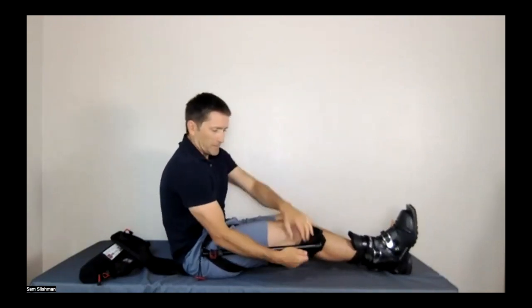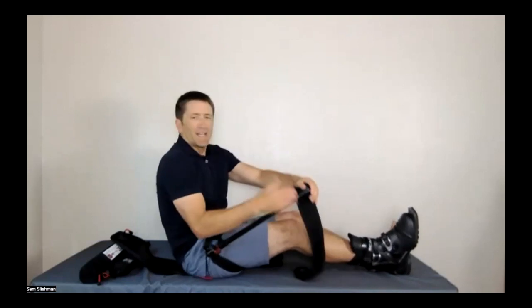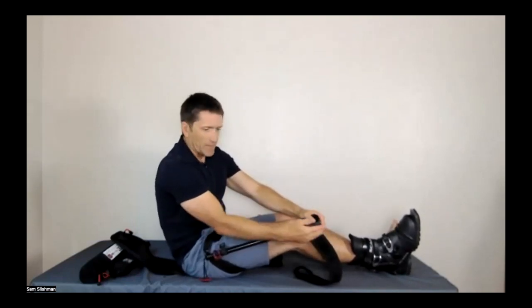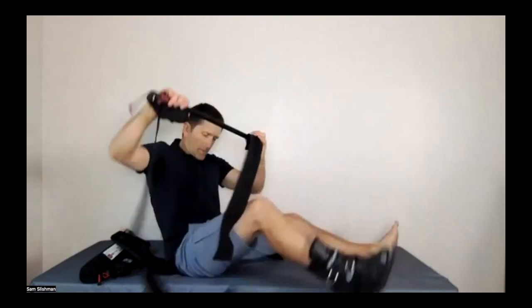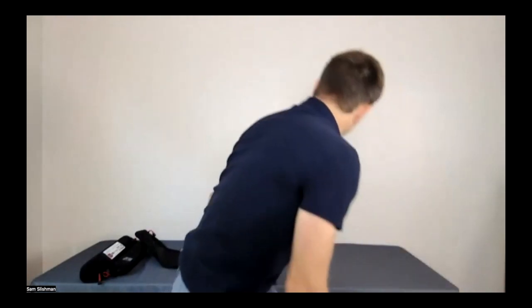And I will say these other things. There's other points about it. It doesn't extend past the leg at all. That was obvious. This fits everybody, kids, adults. And let me put this down here. What I'm going to do is the Gen 2 next.